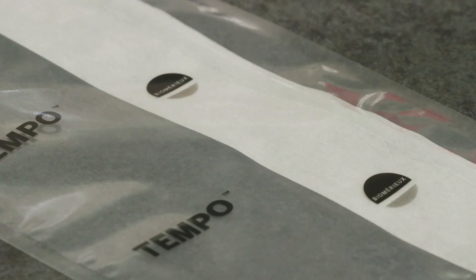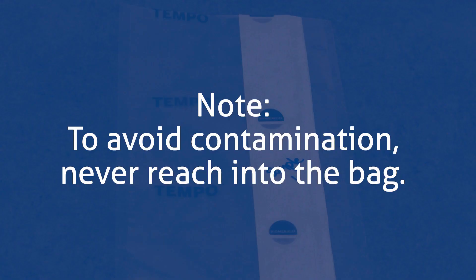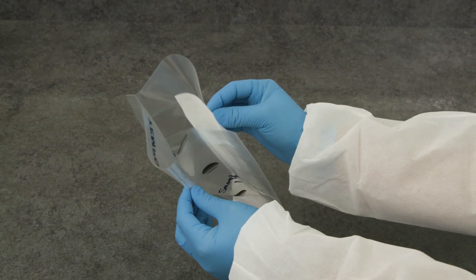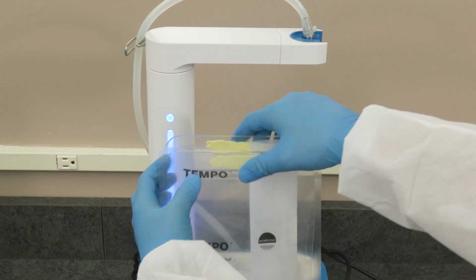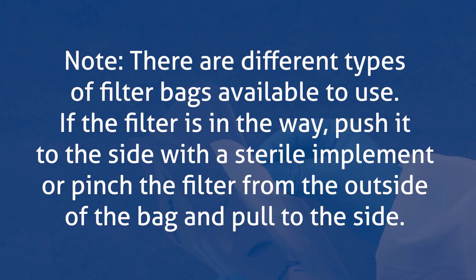Begin by labeling your sample bag with the sample name or ID number. To avoid contamination, never reach into the bag. Aseptically open the bag. The bag is separated by a lateral filter. It is important to put your sample into only one side of the filter. Note: there are different types of filter bags available. If the filter is in the way, push it to the side with a sterile implement or pinch the filter from the outside of the bag and pull to the side.